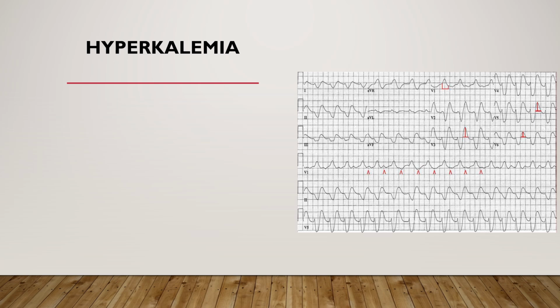Let's take a look at hyperkalemia, which was often called the syphilis of electrocardiography or 12-lead EKG. The reason why some people called it like that was the fact that syphilis, especially in the past, was notoriously known to mimic many other diseases.